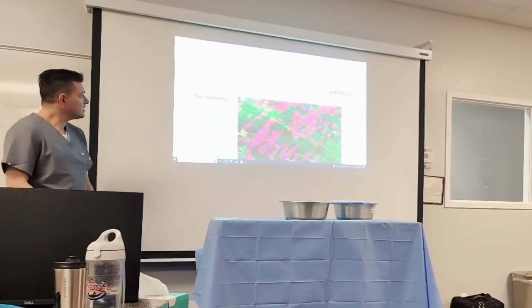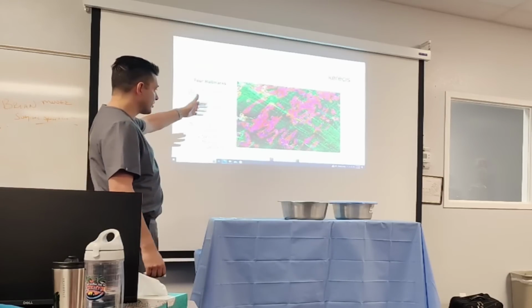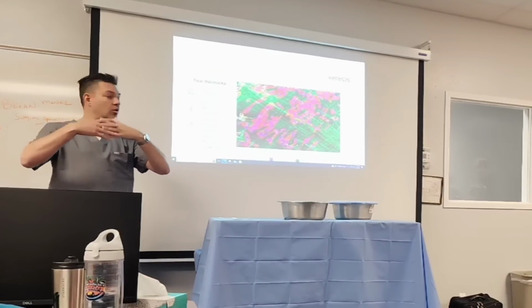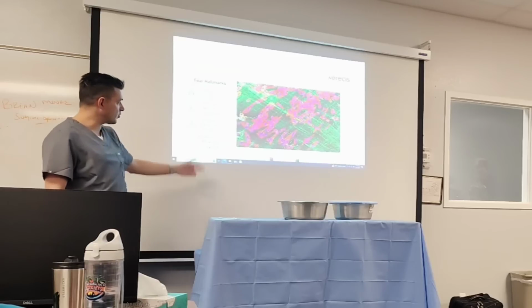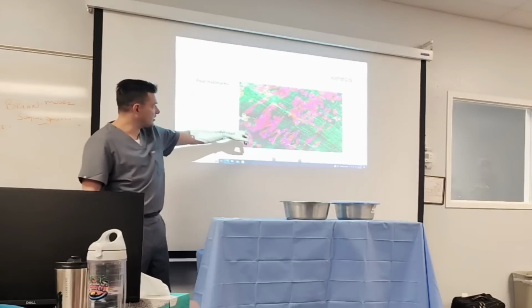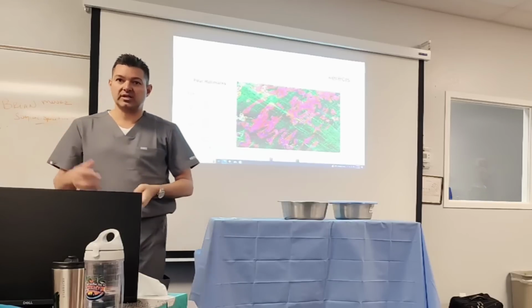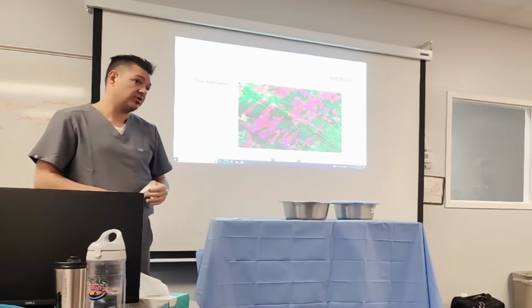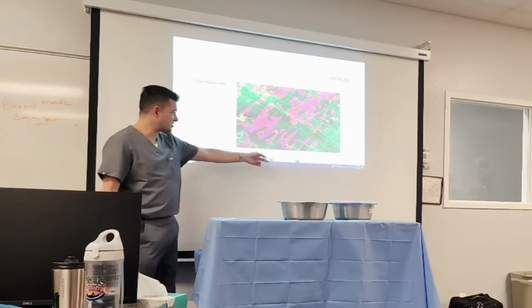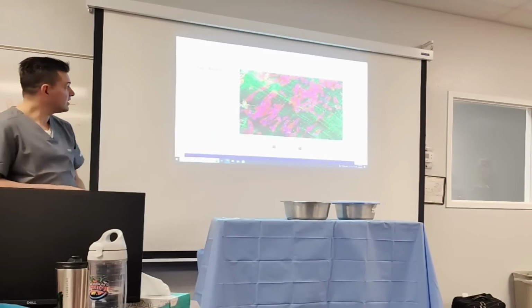Next slide. So this particular slide is basically a summary of the 4 hallmarks that we're talking about, that has that 3D dimensional organization that incorporates all these 4 pieces that we discussed. It has the fibroblasts in the red area, and then you have the Kerecis, so it's meshing together, it's starting to form that epithelialization, which is really important. And this just shows the fibroblasts, the recognition, the migration, the proliferation within Kerecis and how it works. Okay?